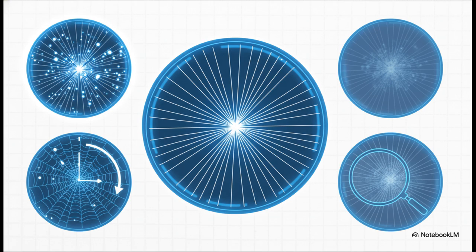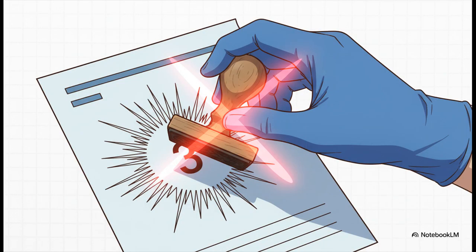And of course, always remember, time is the key for telling scars apart, and even if an AD seems like it's been there for a long time, it still gets the full workup. And I gotta say, I love how the source material puts this next one. There is one unbreakable rule. A radiologist should never, ever call an area of AD a BI-RADS 3. BI-RADS 3 basically means, it's probably benign, let's just keep an eye on it. No way. AD is never probably benign. It is always considered suspicious until you can prove it's not.